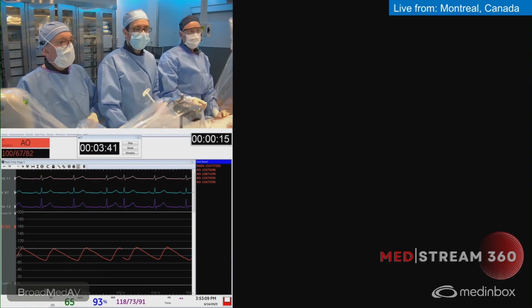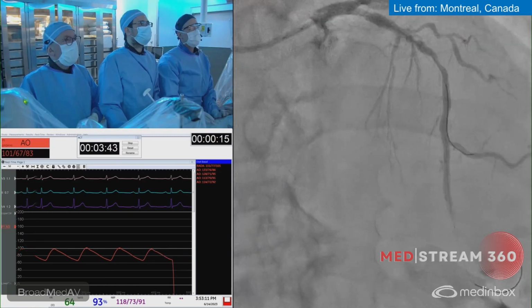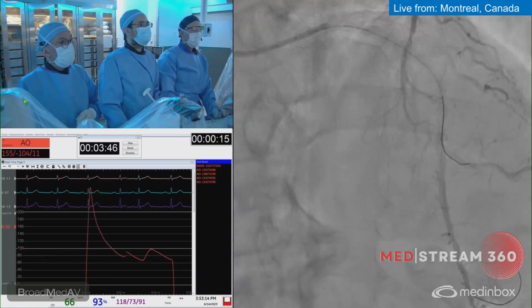So okay, let's do a cine. Yeah, cine, ready. Watch, the wire is still advanced. Very nice. Okay, the diagonal looks good. The result here is good.